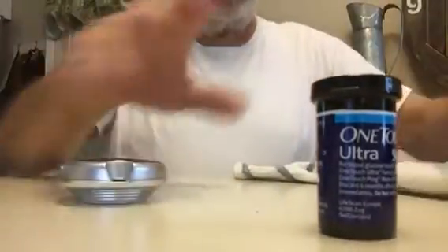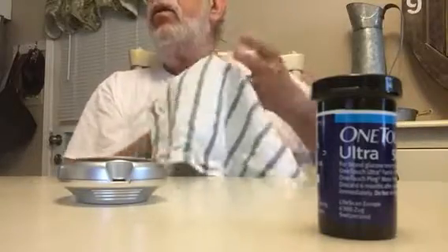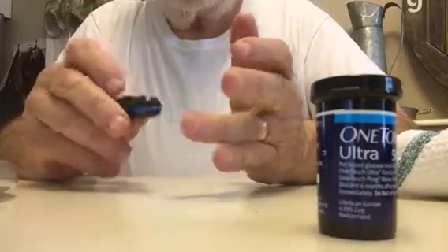You want to wash your hands well. I've run it under water and agitate it with the towel to get some blood flowing up there, then put it right there.